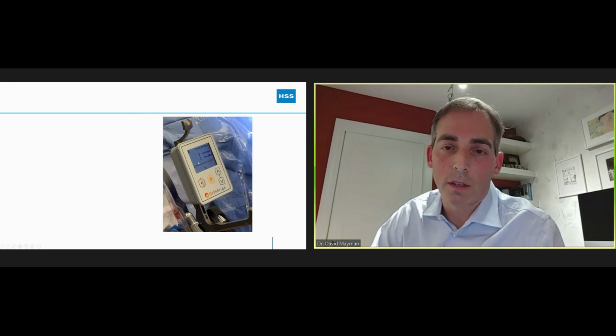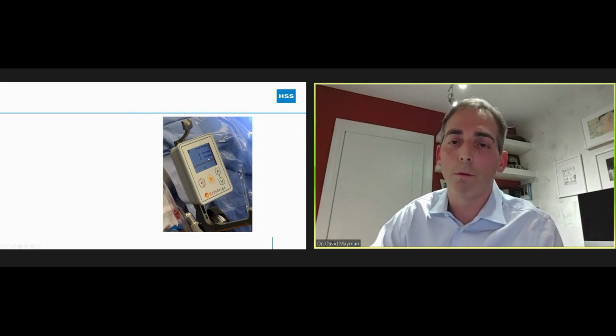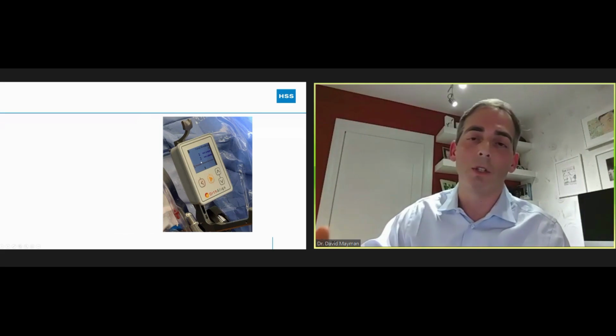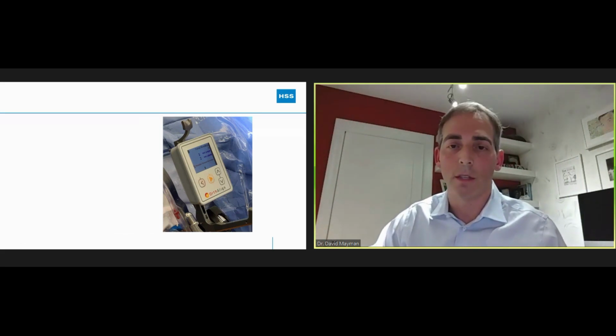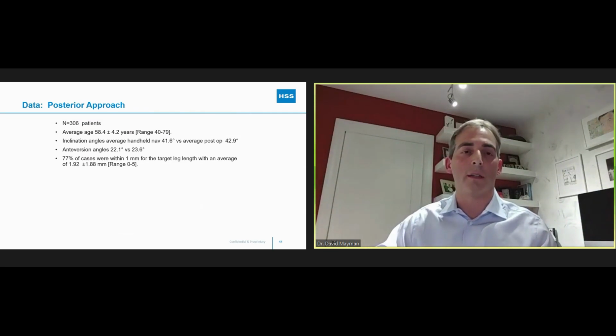All right, so it tells us in this case, we've lengthened the leg by 3 millimeters and we've increased the overall offset by 2 millimeters. And then you look at your preoperative plan and decide how much did you want to lengthen the leg? Do you need to adjust it? Is this appropriate for this patient? So simple to get leg length and offset.